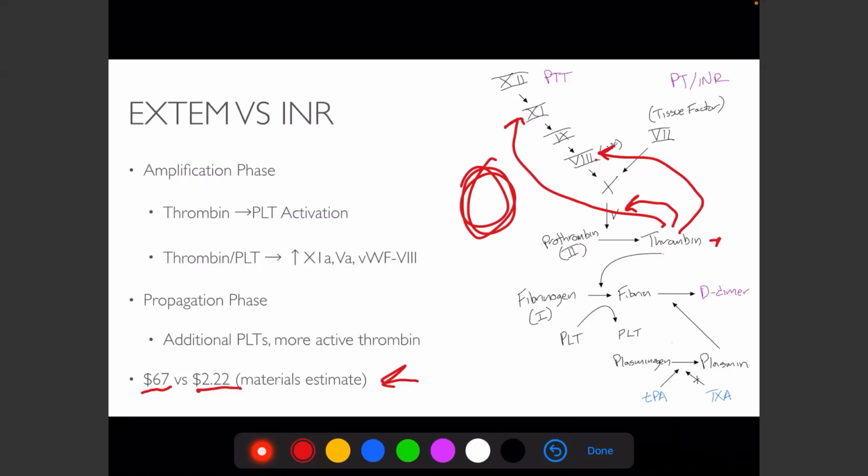If anybody knows, I think it's very interesting because cost has always been a big argument against it because it is a higher cost. You have to QI the people and the machines and buy these reagents, and it's an expensive investment to begin with, which I think has limited its use in other fields. But yeah, if anybody knows, let me know.